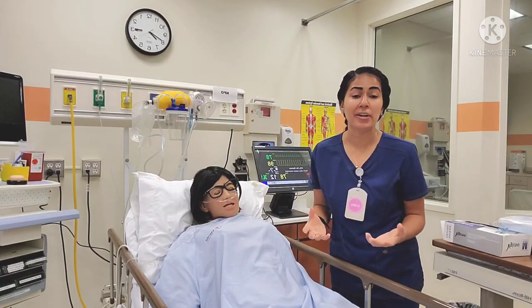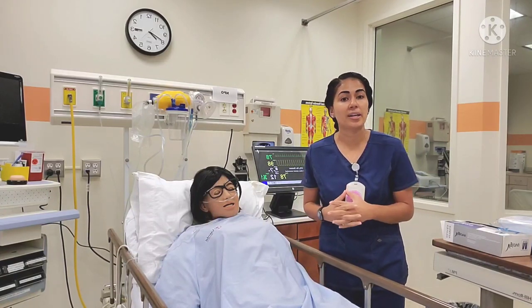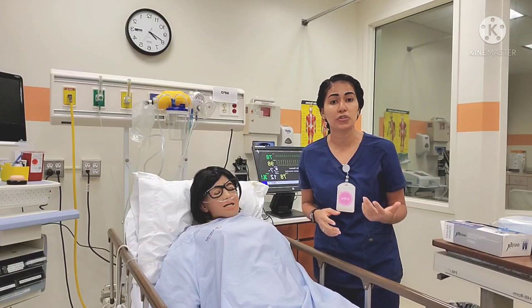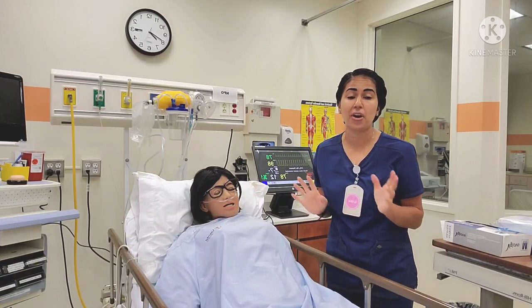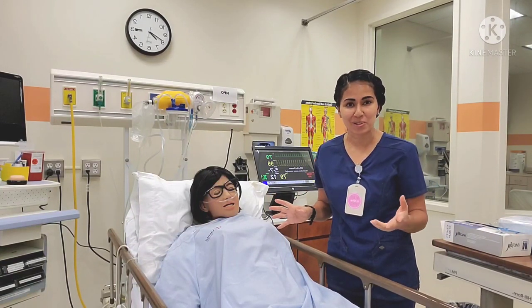Hi nurse family, Nurse Erica here and today I'm going to teach you how to insert an indwelling urinary catheter on a female patient. So stick around.